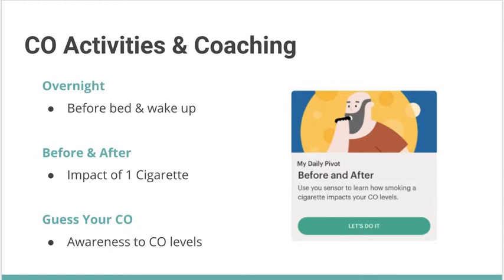So last but not least, we have 3 new CO activities in the app itself. Many pivoters find that the breath sensor is really helpful for motivating them when they're maybe on the fence, when they want to quit, or whether they want to quit. And sometimes it helps them stay motivated to stay quit because they like to see those green values.